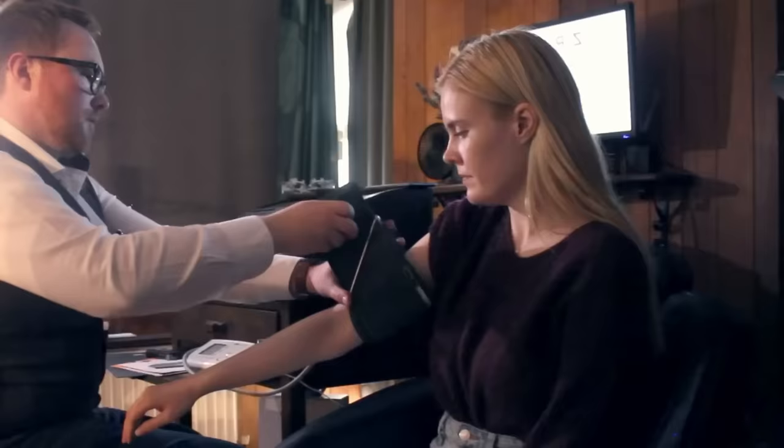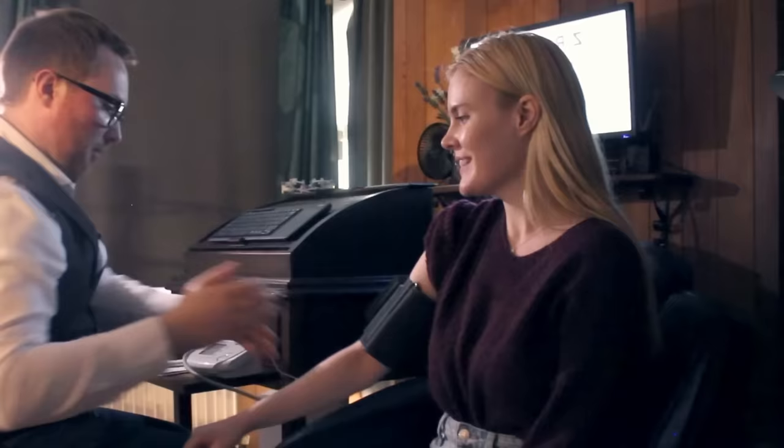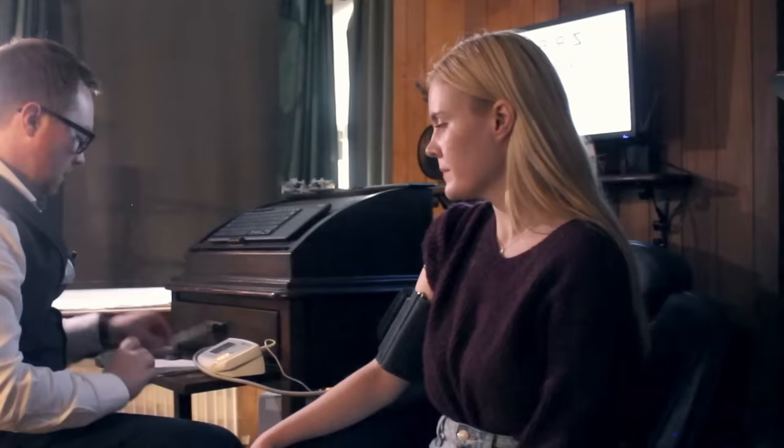Now, it will feel like it's trying to pull your arm off. It does let go, don't worry. So I'm going to do an average of readings. We'll do a first one, give it a minute or two, then we do a second one. And if there's a major difference, we'll do a third. But let's just have a look at the first two readings.